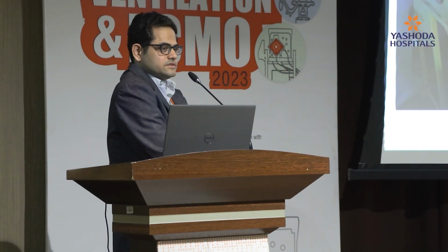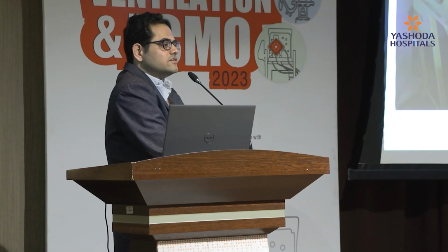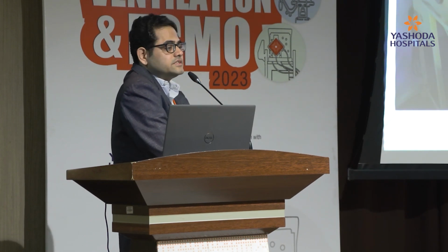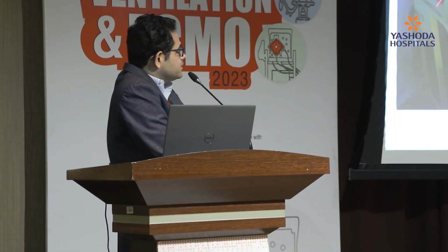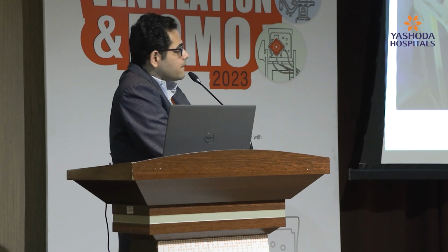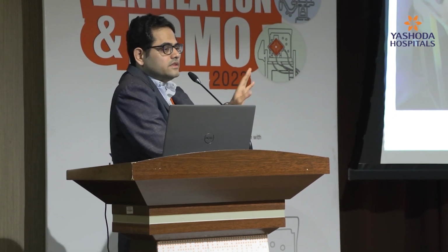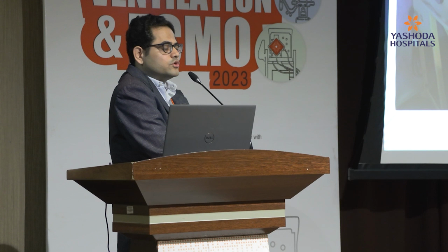Then, what are the ventilators? This is a negative pressure ventilator. Has anybody seen a negative pressure ventilator? It is now not in use. It was commonly used in European countries during the polio epidemic. Negative pressure ventilation is nothing but a mimic of spontaneous breathing. The complete body is enclosed in an iron carcass, which is also called an iron lung. The negative pressure applied is transmitted to the intrapleural pressure and the patient breathes. Nowadays this is not used. The iron lung was probably last used in the 1990s. We have included this just for discussion.